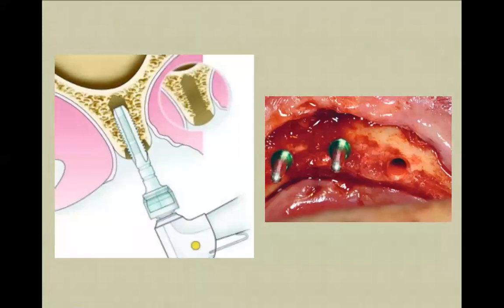Well, sometimes if the bone is strong enough, and not only in the region of the cortical plate here, but also inside, you need pre-tapping. For the pre-tapping, you're using a very strong, very tough stainless steel bur with a very low RPM, like 20, 70, something like that, to create internal threads.